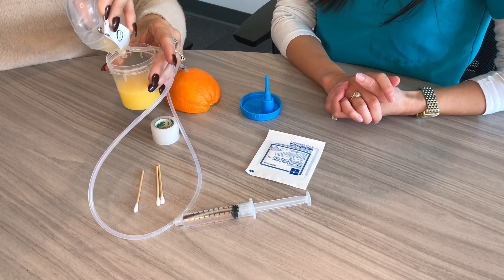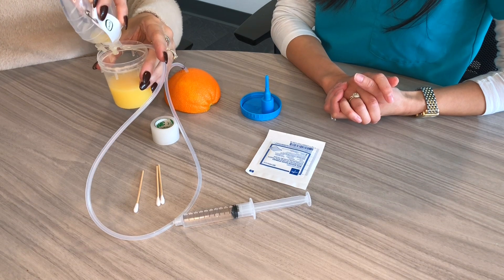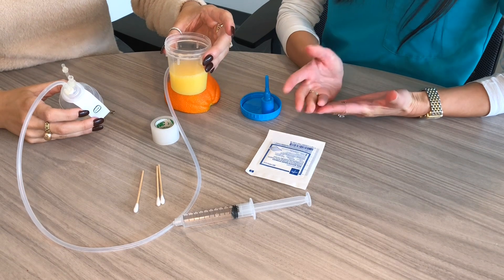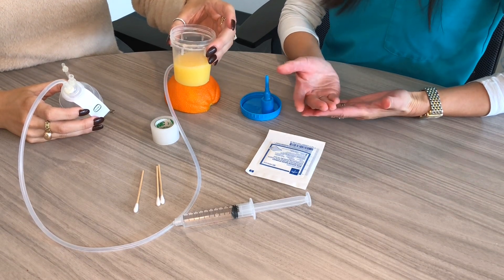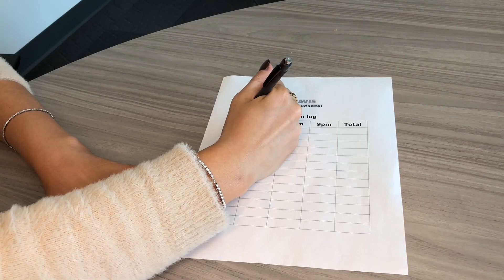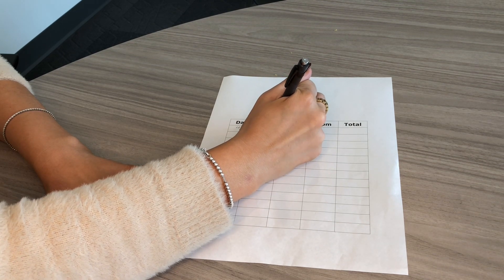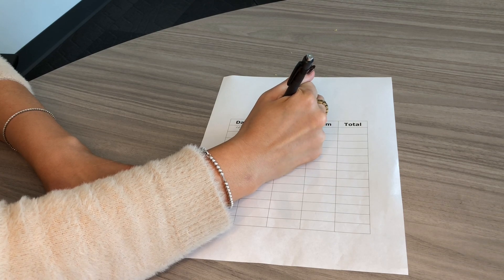In your log, you're going to want to note how much came out of the drain and what type of drainage it is — for example, if it has pus or if there's blood, what color, things like that. So I'd log today's date, 12-1, the color orange, and 10 milliliters.